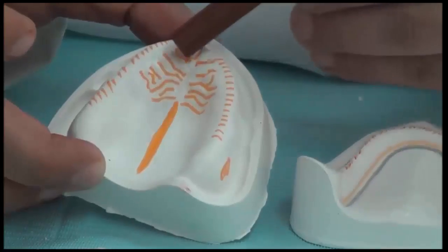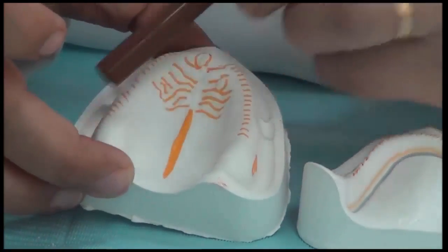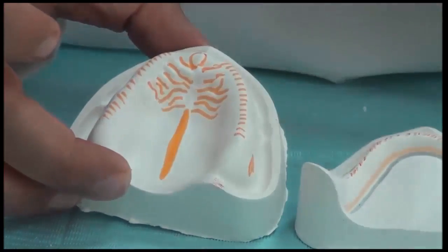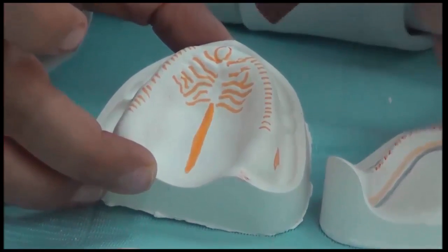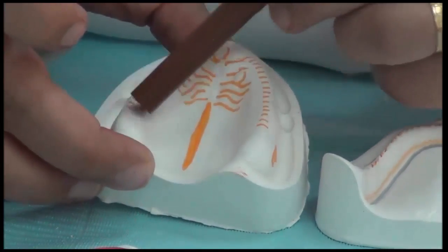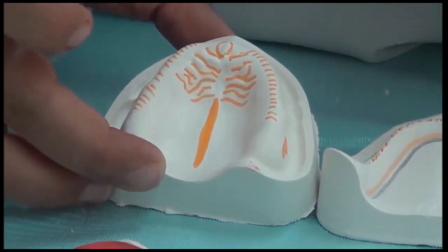So these areas should be relieved, while the rest, in white, of the basal seat area are what we call primary support structures. The tuberosity is a secondary support, especially if it's fibrous and firmly attached. This firmly attached tissue, this bulbous tuberosity, could provide good support, but it's called a secondary support area.